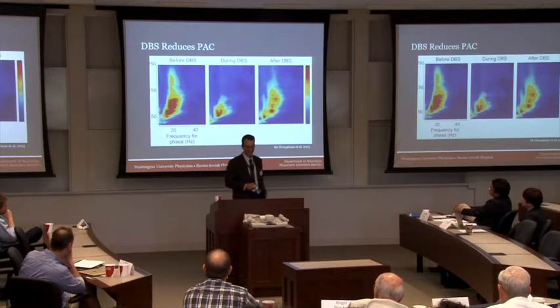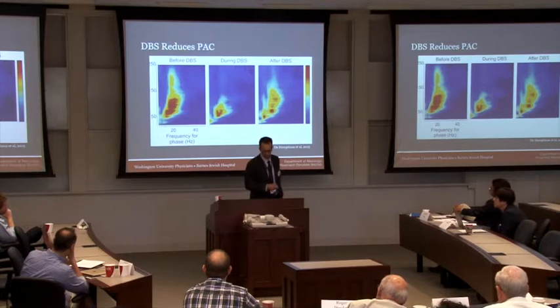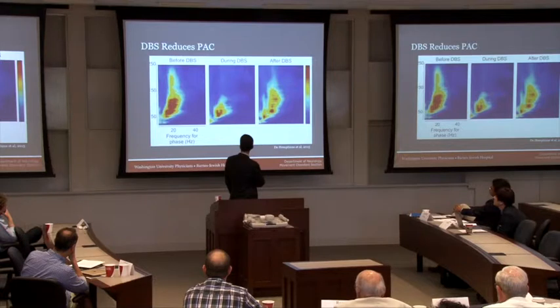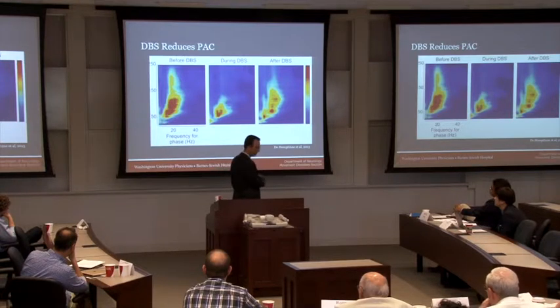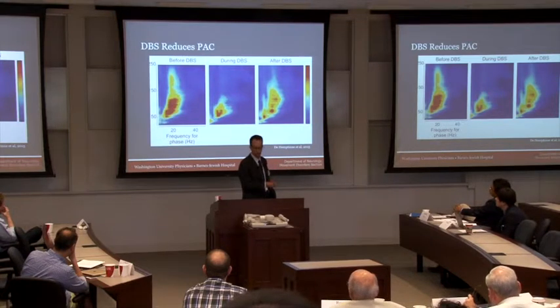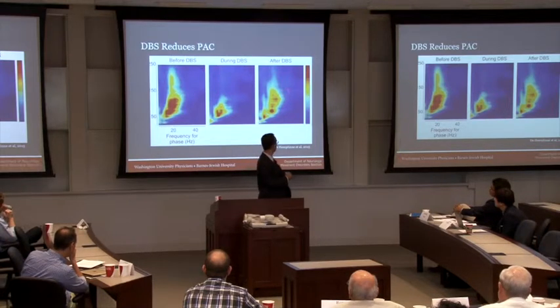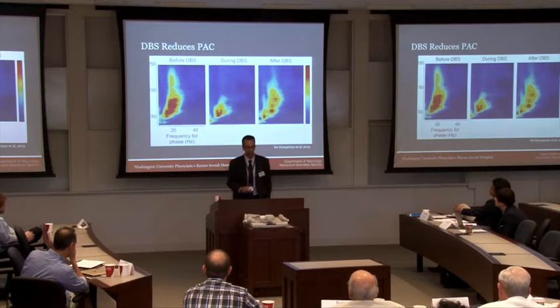And so in Parkinson disease, in deep brain stimulation surgery, we see that, right? This is the sentinel paper on phase amplitude coupling, where on the left we have before deep brain stimulation surgery. This is the beta range, so this is the frequency from 0 to roughly 50 hertz. And on this axis here is the gamma range. Unfortunately, this got cut off, but this is 250 hertz, so 0 to 250 hertz. We see a very nice coupling in the disease state prior to deep brain stimulation, turning on the device. When we turn on the device, we lose that coupling in the gamma range, and then again that returns once that DBS device is turned off.